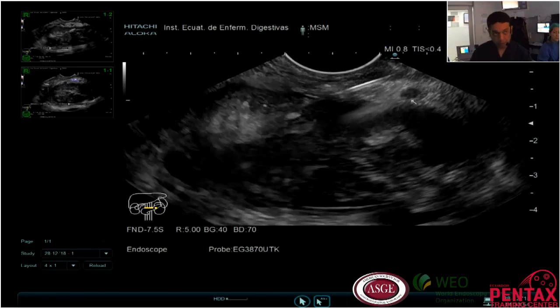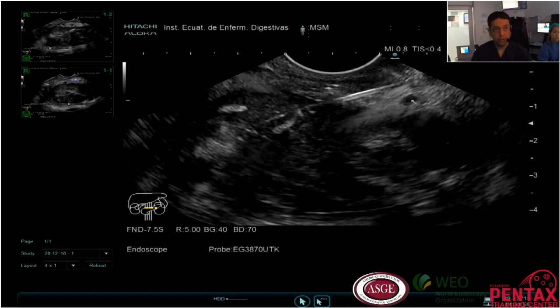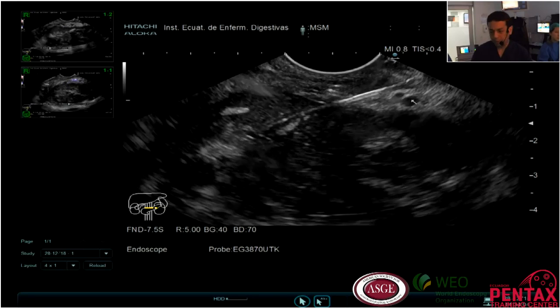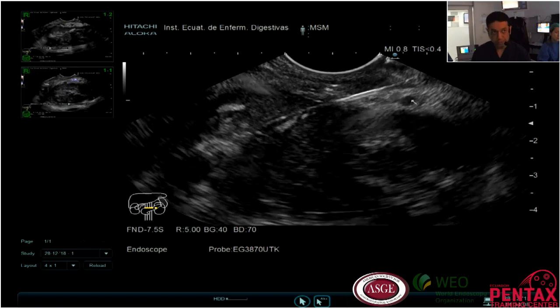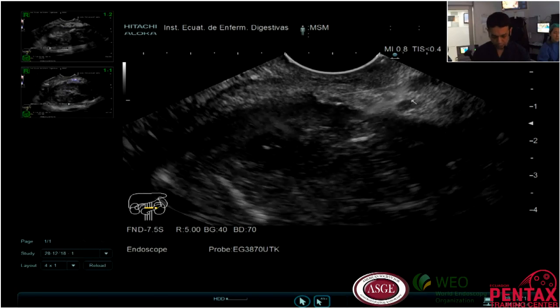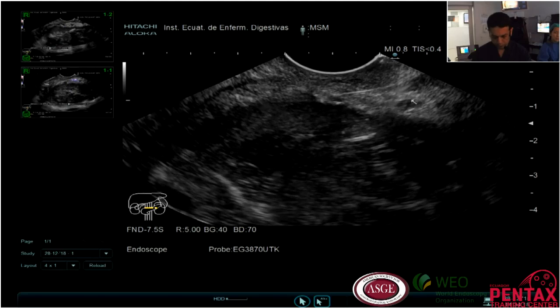So I am putting my guide wire just to be followed. We don't need to use fluoroscopy. Some of you already performed this kind of drainage, but with the use of Axios and hot Axios now it is not necessary to use it anymore. Suelta, por favor.